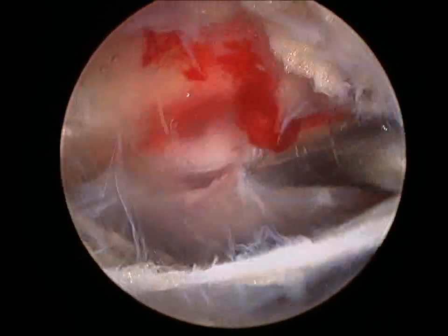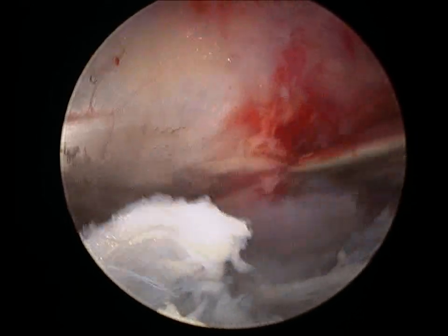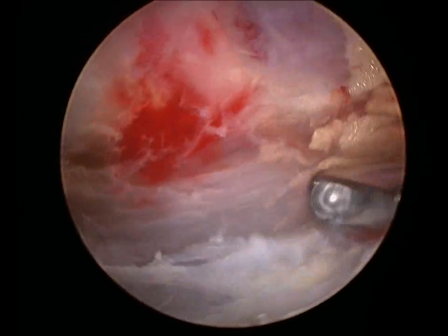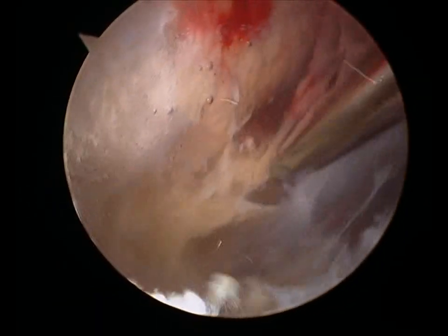Here you can see this shaver is eating away that bursa tissue. It's very thick and inflamed in this woman. Once we've removed enough of the bursa, we'll be able to see the tendon of the vastus lateralis — you can see it up there on the left. And then to the right, we'll see the gluteus medius insertion, which is another muscle that inserts onto the hip. Here you can see some more bursal tissue that we're removing, with the vastus lateralis tendon over on the left side of the screen and more bursal tissue posteriorly.